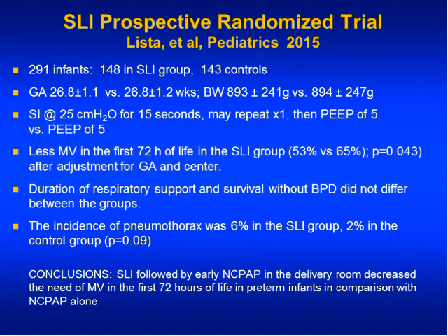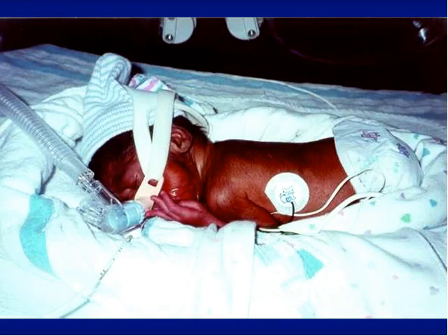multinational clinical trial underway that I'm leading along with Harish Kirpalani and Peter Davis from Australia. It's taking place in the US, in Australia, in several countries in Europe, and a couple of sites in Canada. Which will hopefully ultimately tell us whether this is in fact the right intervention. So stay tuned. We are not recommending that this be done as a matter of routine, but it's a promising way to get these babies started, and the hope is that it will allow these babies to fairly rapidly establish adequate lung volume and subsequently be able to breathe spontaneously.